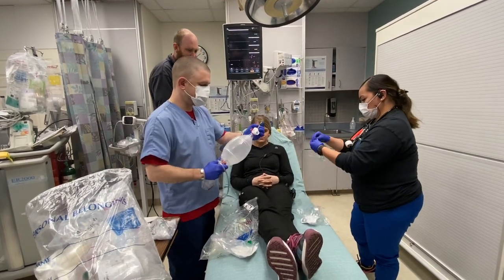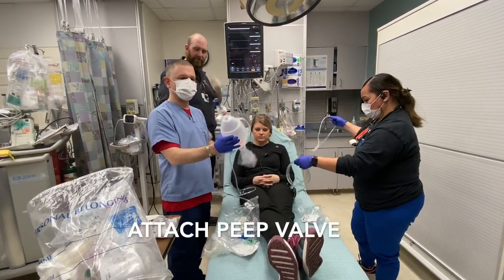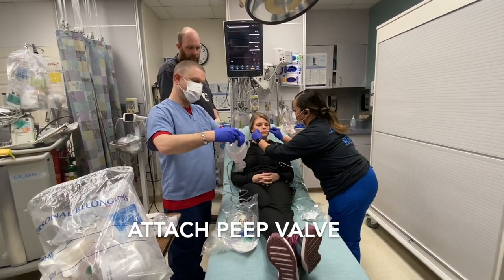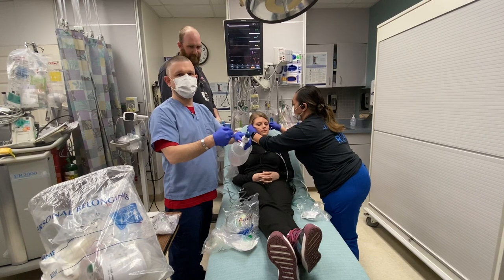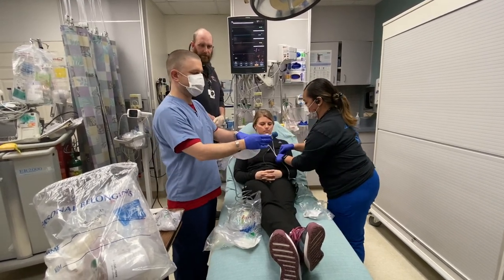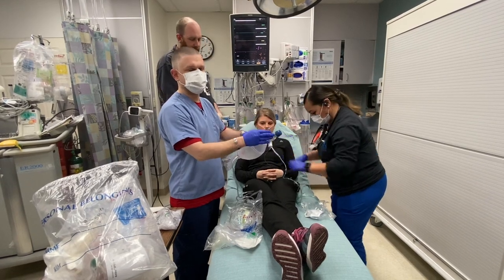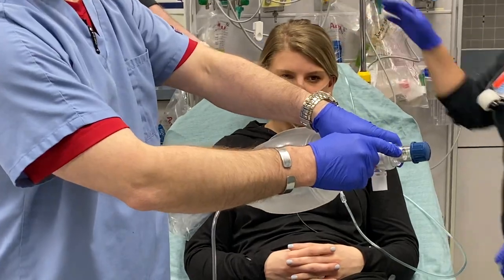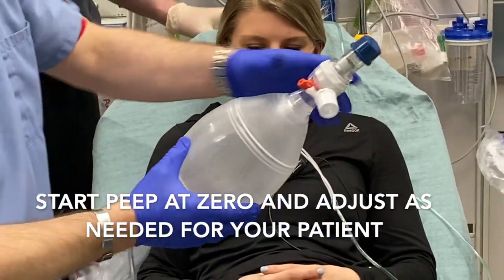All right. So the next thing is you get your BVM out. You have your PEEP valve on. The PEEP valve is pretty self-explanatory, but it goes on the exhalation port of every standard BVM. You want to dial that PEEP to zero to start. Dial the PEEP to zero.